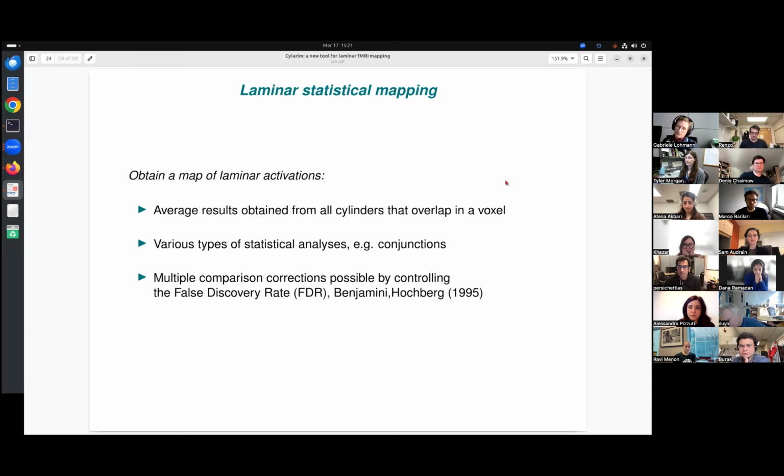For instance, we certainly do not want to impose any Gaussian spatial smoothing. That wouldn't make sense at all. So what I would suggest to do is simply use the false discovery rate as it was proposed by Benjamini and Hochberg in 1995. There's this famous paper that was cited, I don't know, hundreds or thousands of times, and one can use that.